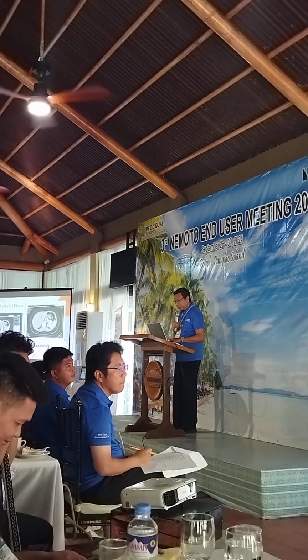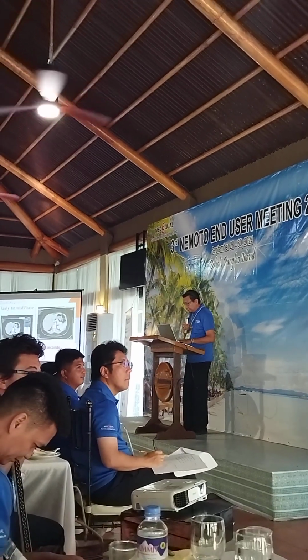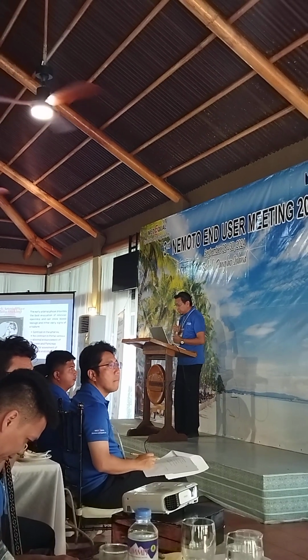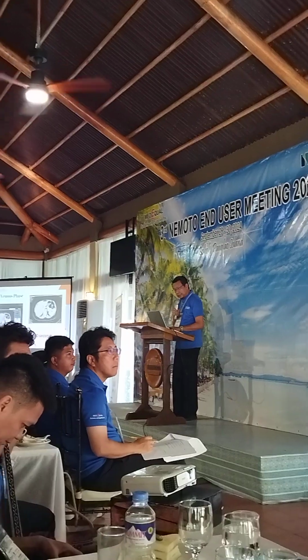So, the delayed phase captures delayed contrast enhancement in the liver, useful for detecting late enhancing lesions or assessing biliary obstruction. So, these are the phases.